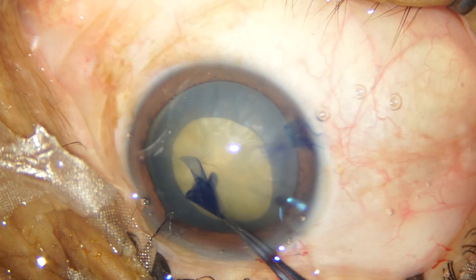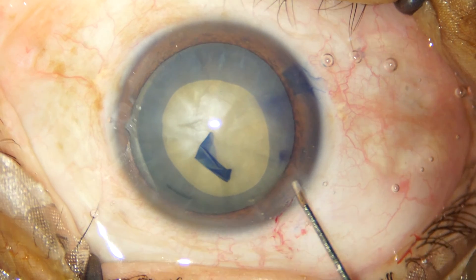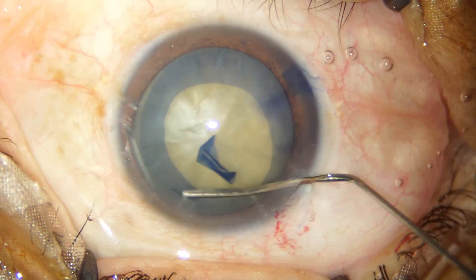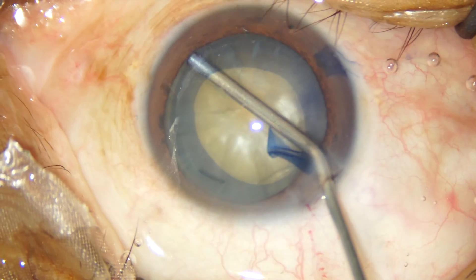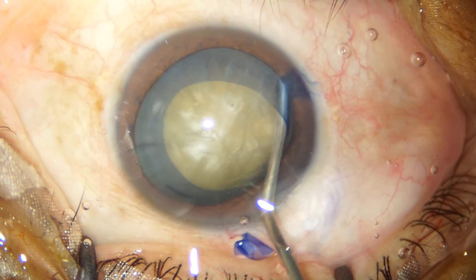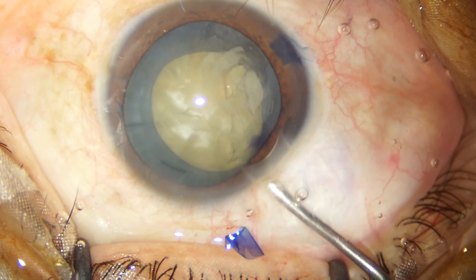Thankfully there was not much intumescence in this cataract and we didn't have any rhexis runoff. I attempt to rotate the nucleus with a 27-gauge cannula without doing a hydrodissection, but it appears to be a very sticky cataract, so I am going ahead with a visco dissection in multiple quadrants to try and release the adhesions between the nucleus and the capsule.